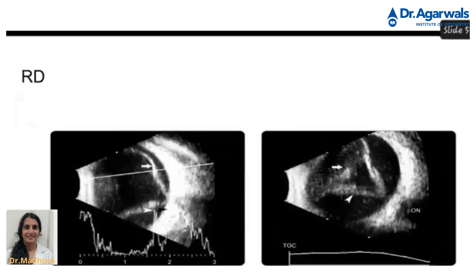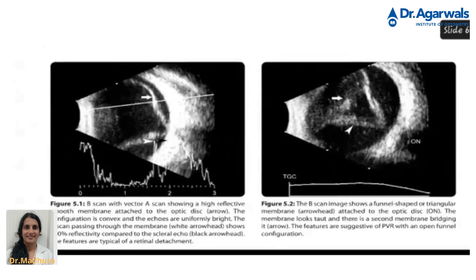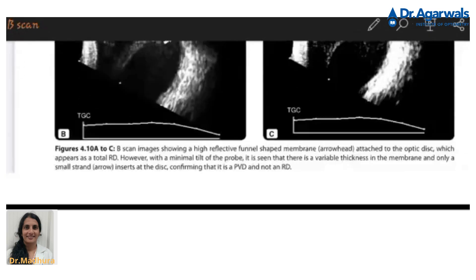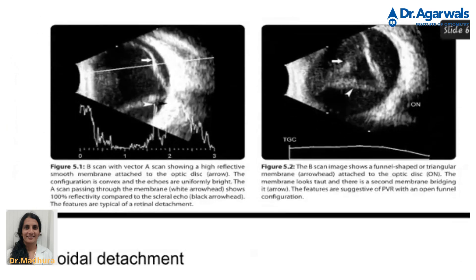Now another RD example: compared to the previous slide, you can see a funnel-shaped retinal detachment here. This is a smooth, highly reflective membrane which is attached to the optic disc. When doing a dynamic scan, you can see that its movement is pretty short compared to a PVD, which would show more dynamic movement.